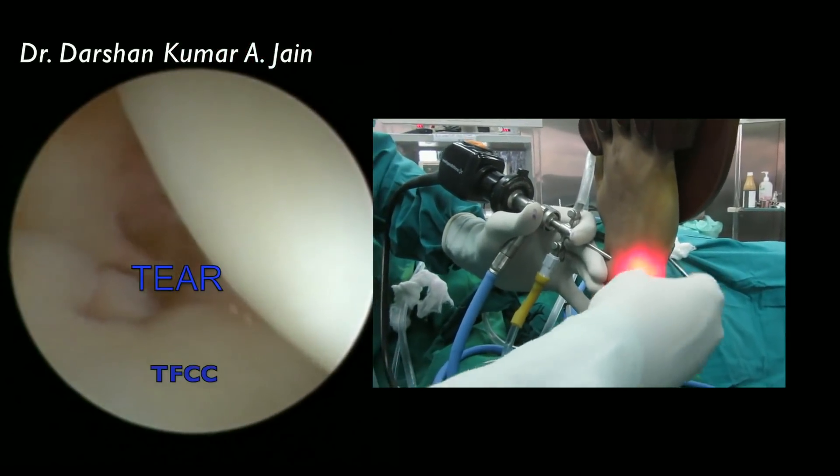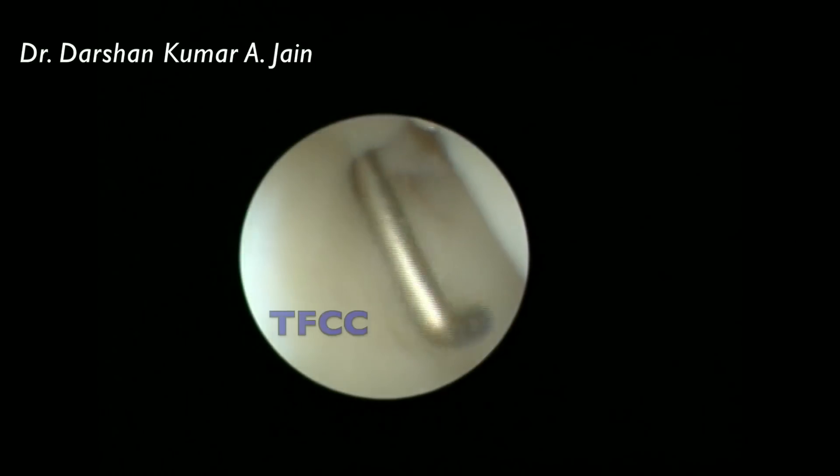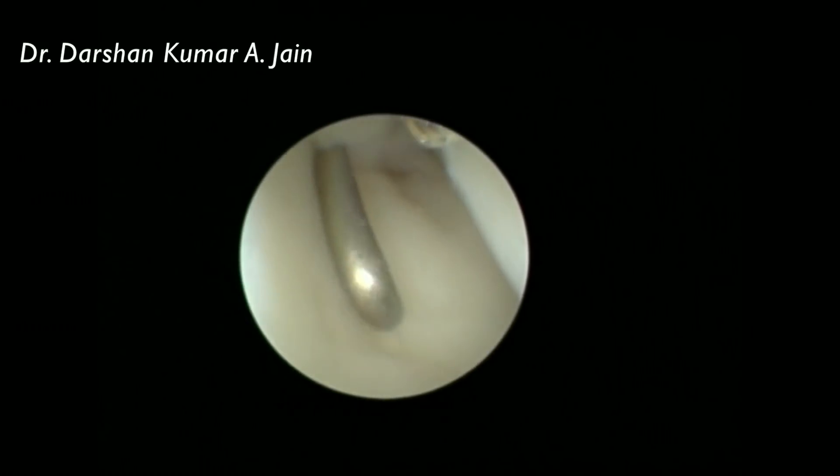That's the tear of the capsule on the dorsal side and the TFCC here. That's the needle which is accessing the 6R portal. A blunt hemostat is then used after making the incision on the skin. The synovial hypertrophy is debrided using a 2 mm or 2.4 mm shaver. Now the TFCC is checked for the trampoline effect — normally this is good and taut. If the effect is lost, that means there is a TFCC tear.